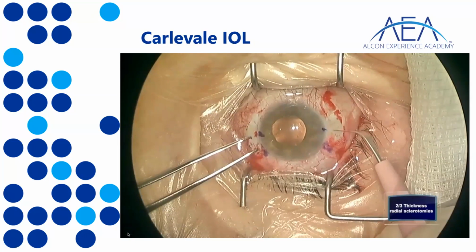The original technique that Carlo proposed was to create a scleral port here, so 3 millimeters by 3 millimeters, and create a port here and here. This is a revised technique, so there is only one single cut done in the middle, and then with the crescent blade you can create a small pocket inferiorly and a small pocket superiorly to this cut, and you'll see it in the video right now. This is a quicker technique which has exactly the same results as the original one.